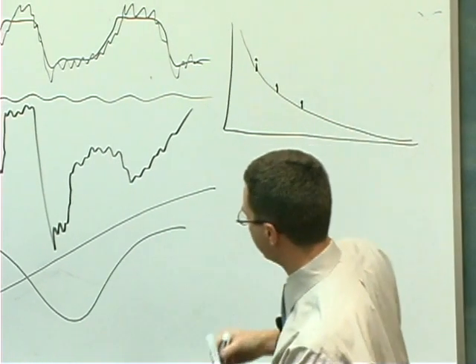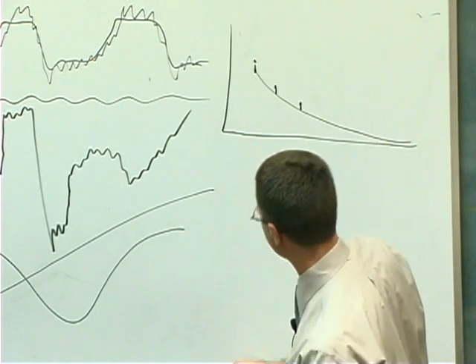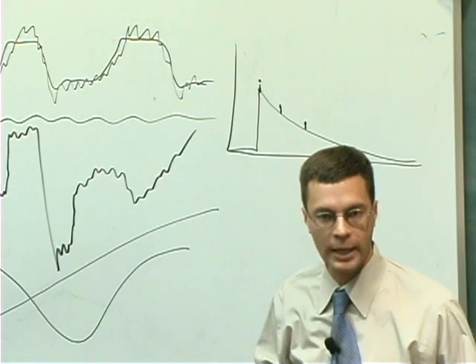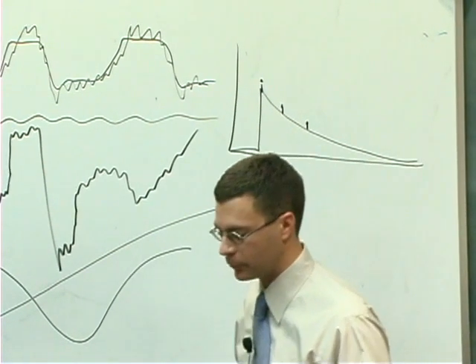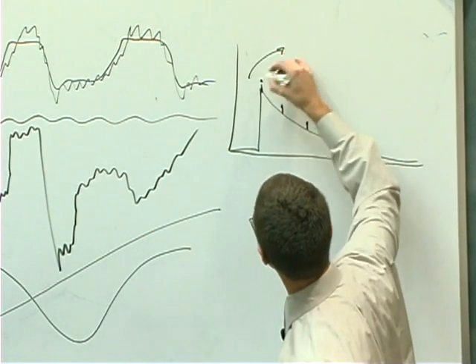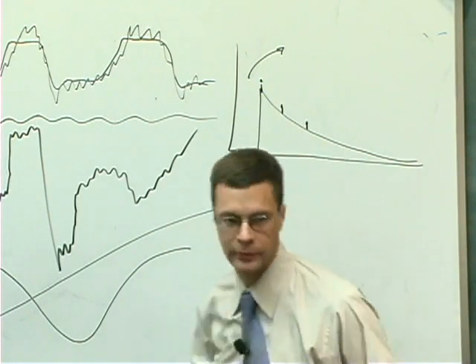What we'll do is we'll digitally filter all the frequencies which are below that of your task, so that it looks like that. Okay. So in SPM and in Voxbo and other software packages as well, typically there's a technique that exists for smoothing your data or filtering your data to remove low frequencies.